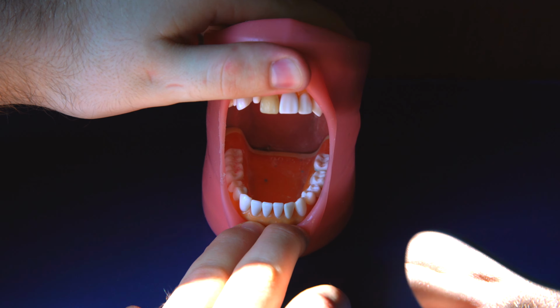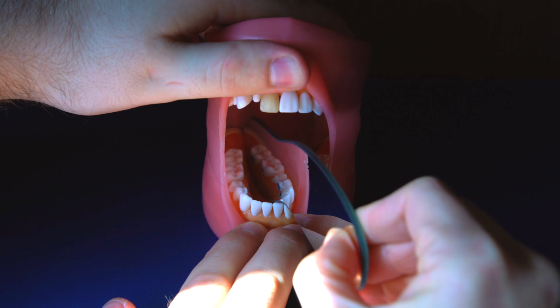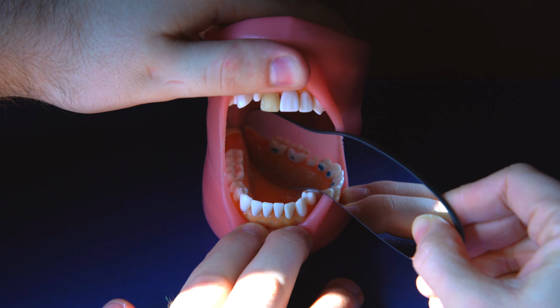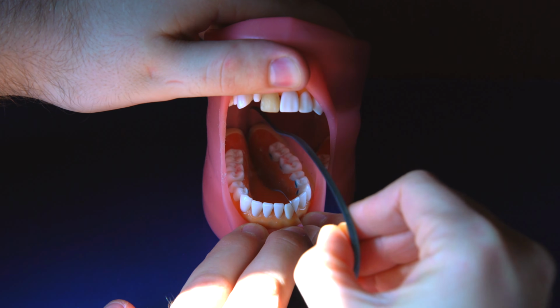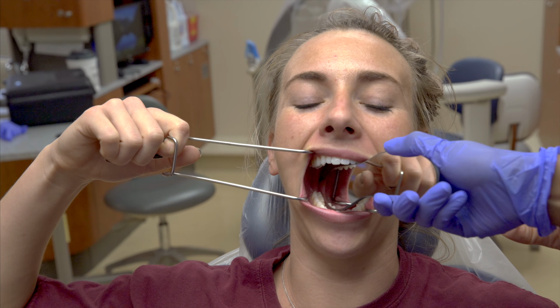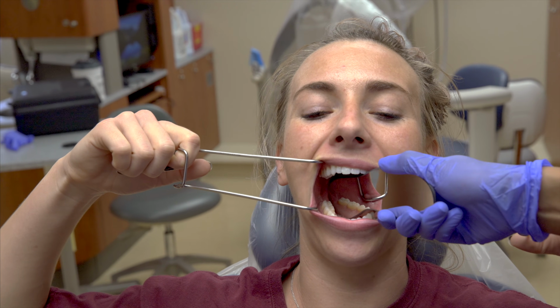The next images we will take are the lingual shots. We use a 2B mirror for these. Certain photographers like certain ends of this mirror. I tend to place the rounder end of the mirror into the patient's mouth, but I'll leave that up to the photographer. For the mandibular shot, slide the mirror into the patient's mouth in between the tongue and the alveolar ridge. Then, angle the mirror from the retromolar pad to the canine area.